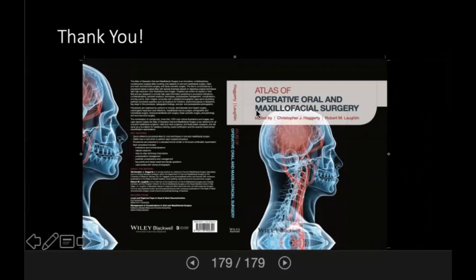It is correct that you may take an osteotome and very gently and lightly tap that into the posterior maxilla to really thicken the bone. That is a great way to do it. However, we can also undersize the osteotomy with the drill and use a tapered implant. If you are going to place a 4.1 diameter implant, your final drill would be a 3.5. If while you're drilling you have really soft bone, use your 2.8 drill, stop, place your 4.1 millimeter diameter implant, and skip the 3.5 drill. That way you are undersizing the osteotomy and you'll get a higher insertional torque value. You do, of course, have to worry about doing that in the mandible because of pressure necrosis and things like that. But in the maxilla, yes, you can do that.